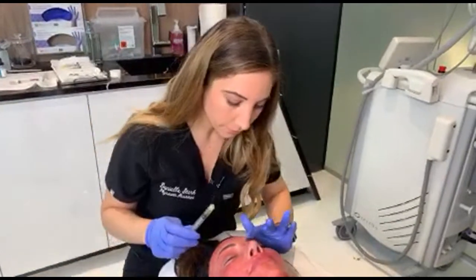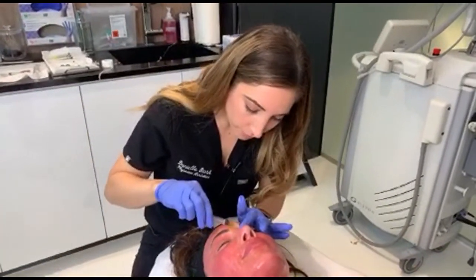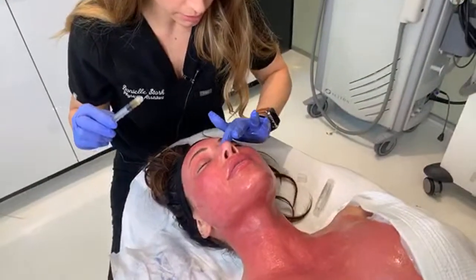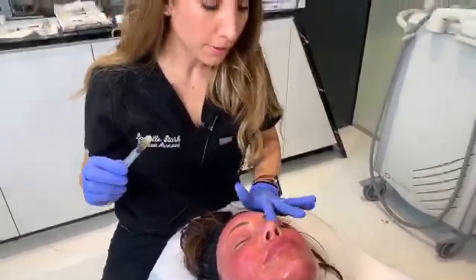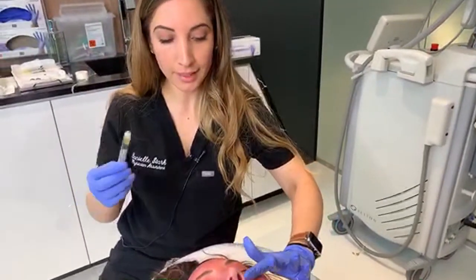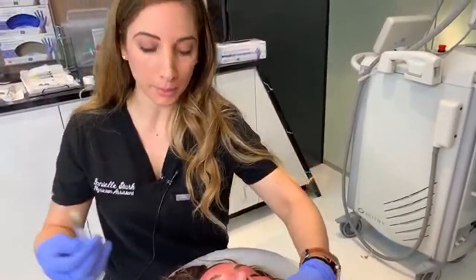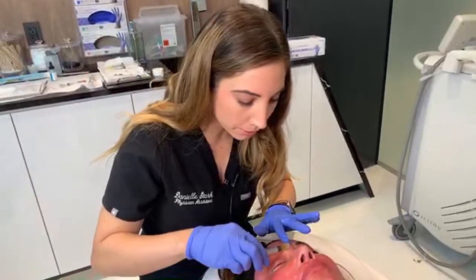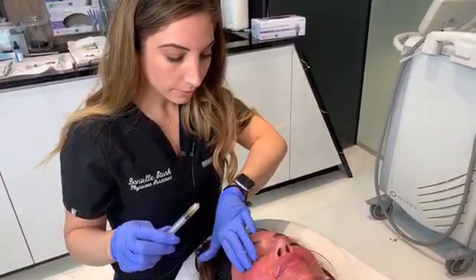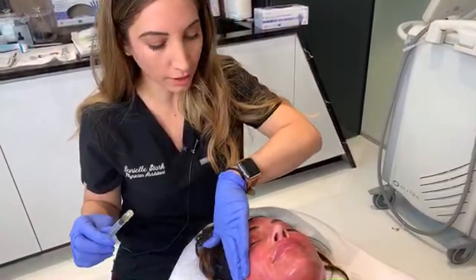Kim is asking if the microneedling is similar to a vampire facial. It is. So I'm going to put PRP over your eyes, just keep them closed. So the vampire facial does use PRP and microneedling. But as a standalone treatment, the microneedling would be a little bit more aggressive than what we did here, for example. But it's a really good maintenance. And it's only the vampire treatment because we're drawing it from your blood.